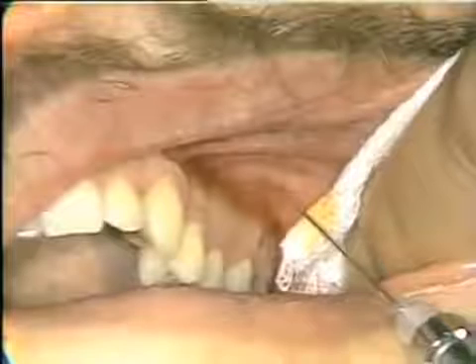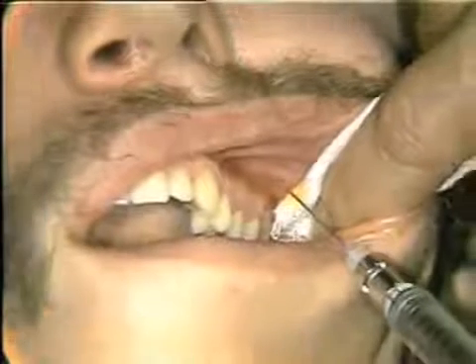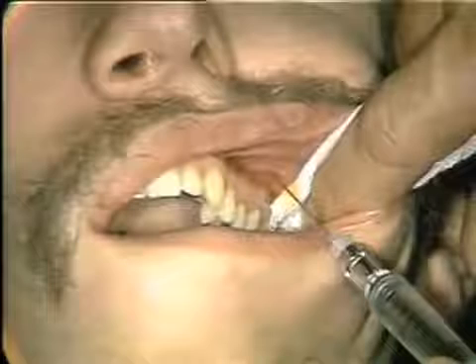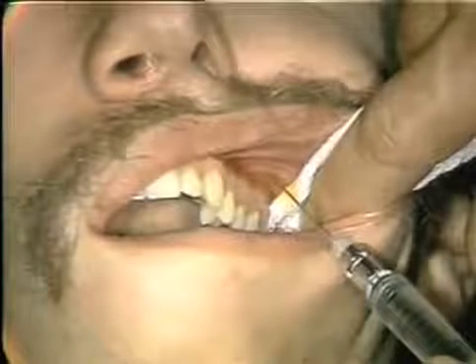Out in the vestibule, and I'm approaching the mucosa at about a 45-degree angle, as you can see. Puncture made, carried quickly to bone, and then we aspirate, and then we'll inject a good 2 cc's of solution to anesthetize the maxillary first molar.